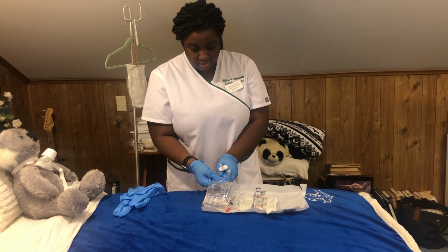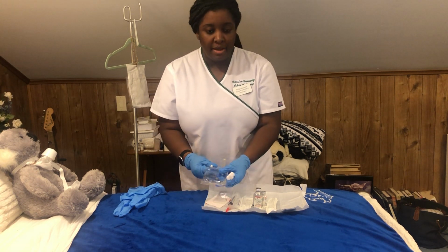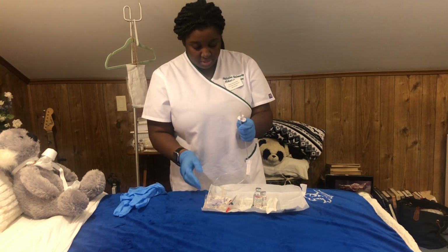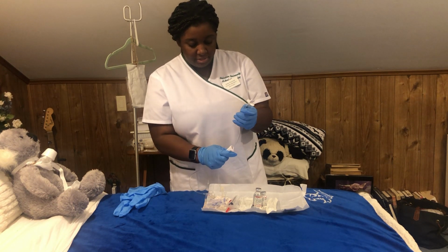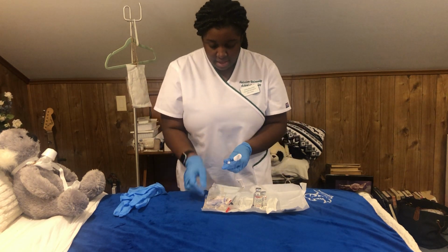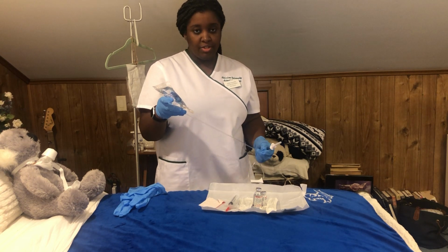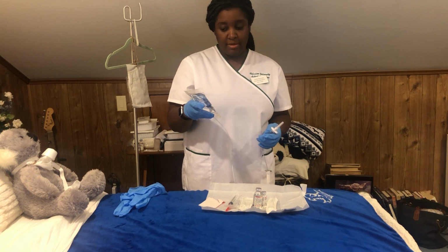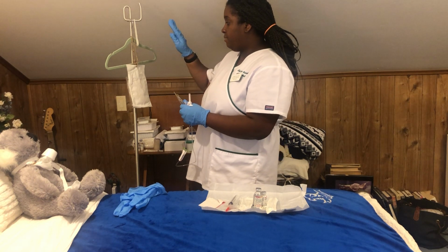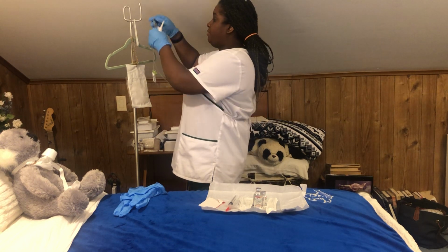Okay, it's connected, and then I will make sure before I move on, because this is a new tube, I will clamp this shut, making sure that it's shut. And then I will prime my tube by letting some flow down, so in order to make sure that there's no air bubbles in. And then I will hang my piggyback pouch higher than the current IV drip that's going on. Okay.